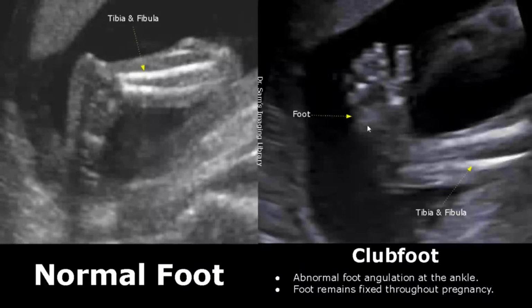Clubfoot refers to a condition in which there is abnormal angulation of the foot at the ankle relative to the tibia and fibula. Normally, the ankle and foot must look like this.